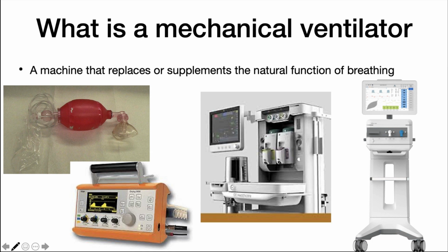In both spontaneous and mechanical ventilation, exhalation results from the alveolar pressure generated by the elastic recoil of the lung and the chest wall. The pressure necessary to move a given amount of air into the lung is determined by two factors: the lung and chest wall elastance and airway resistance.